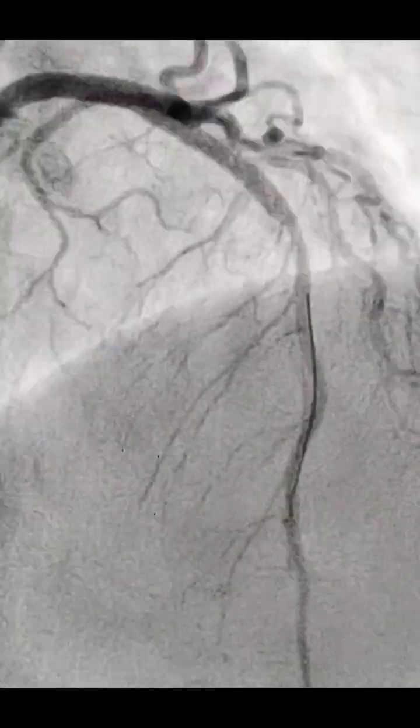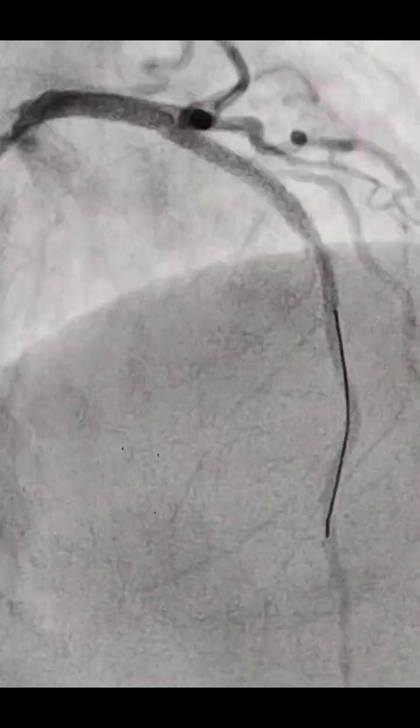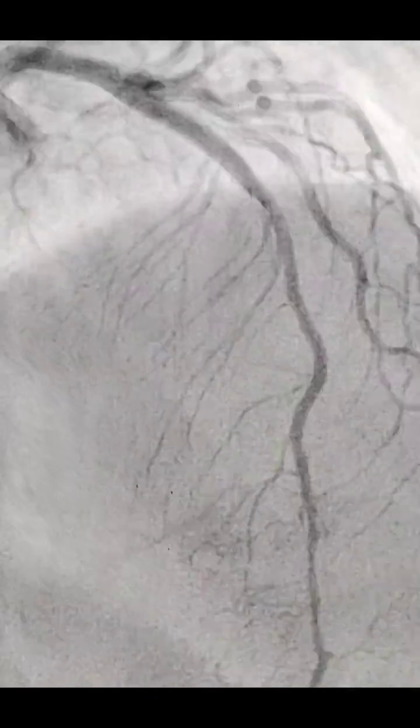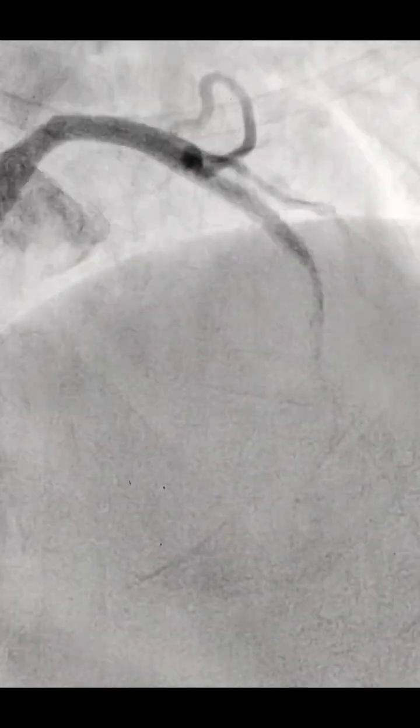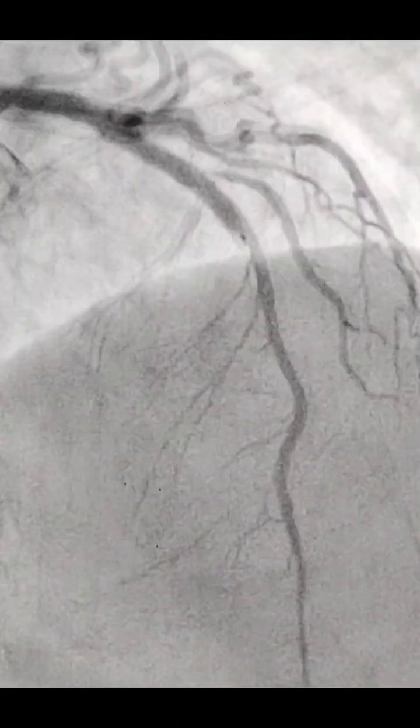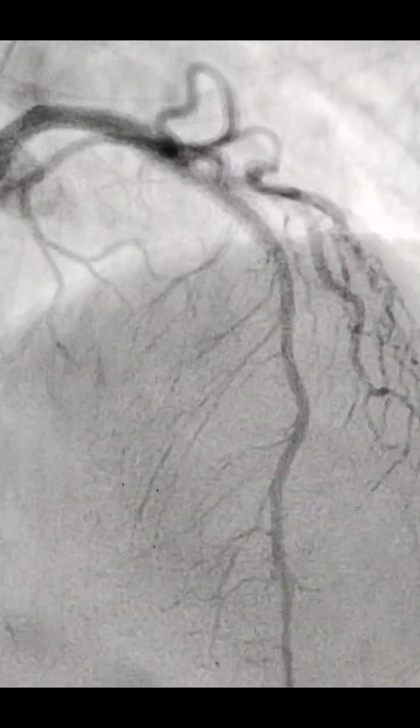So we had to take a long stent because there was a thrombus. So we had taken the 28. It was 3.5 by 28, and this is the final scene. You can see how wonderfully this LAD has opened up, and it was almost a long LAD, type 4 LAD. And then this is TIMI 3 flow, and that sort of haziness disappeared. It was due to step down, step up. So this was the primary angioplasty to LAD.